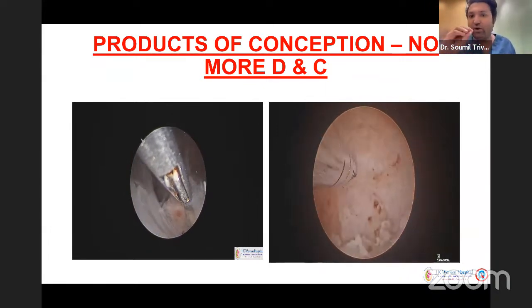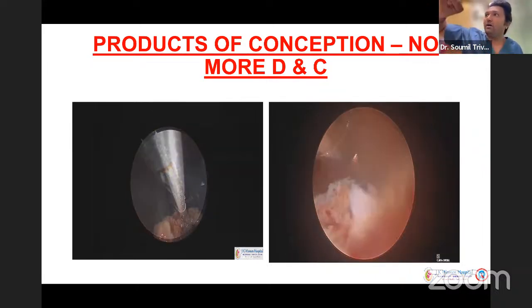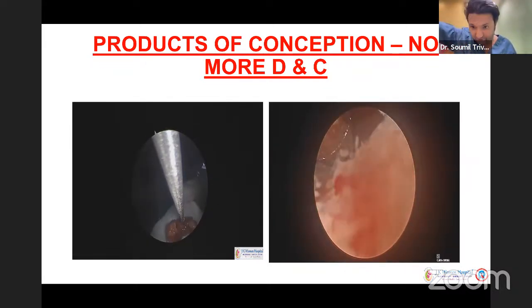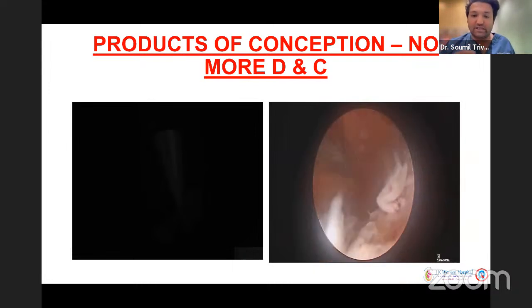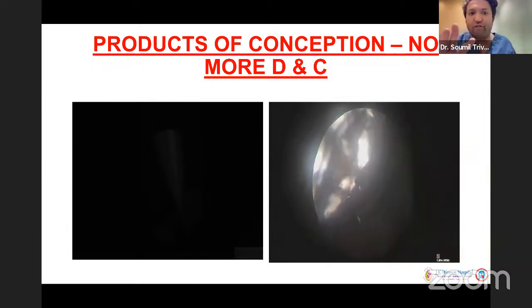And in that also, I don't do hysteroscopic retrieval. I will just go and identify the cavity, because sometimes the cervix is so deviated that you cannot identify where exactly it is, in a didelphic uterus or something like that. So it's my limited experience, sir, but other people can add. I have resorted to hysteroscopic removal of POCs in maybe 8 to 10 cases. So in future, is it true that we should be doing only hysteroscopic removal?